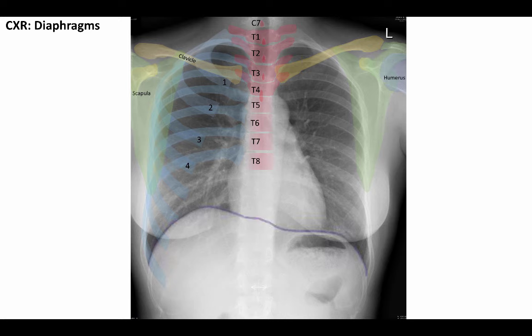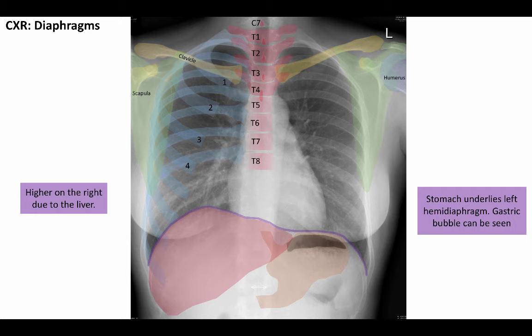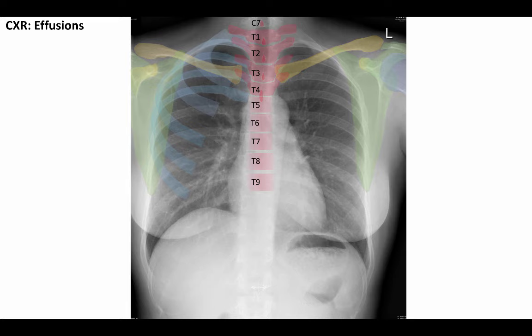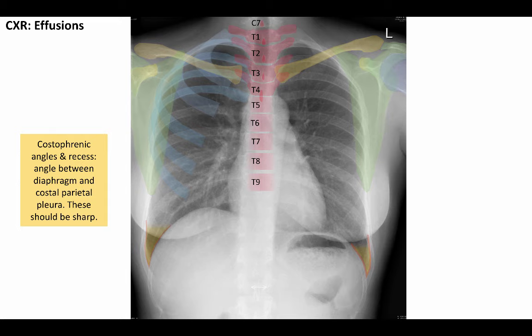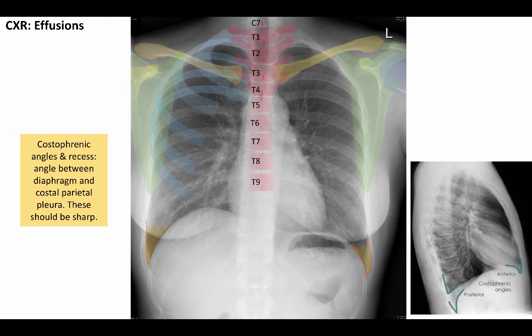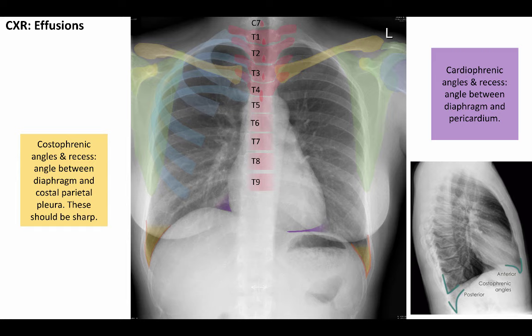Now we will examine the diaphragm. The right hemidiaphragm is higher due to the position of the liver. Under the left hemidiaphragm we can sometimes see the gastric air bubble, and through it lung tissue can be seen. This lower air bubble is gas in our intestine. Effusions can sometimes cause blunting of the costophrenic angles, which are formed between the diaphragm and the lateral thoracic wall. The cardiophrenic angles can also be seen between the diaphragm and heart, but these are usually smooth and not sharp.